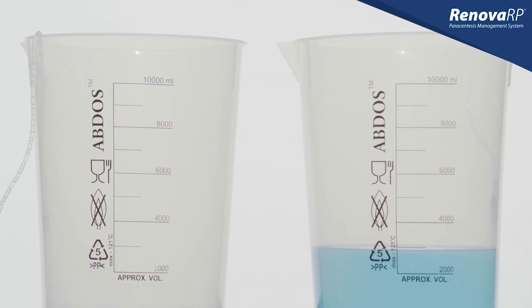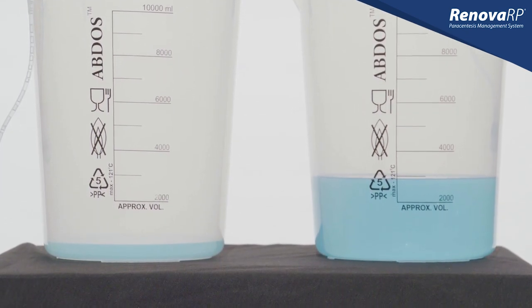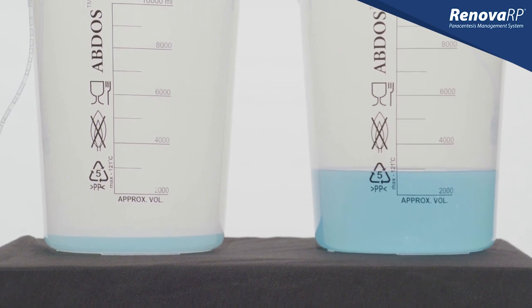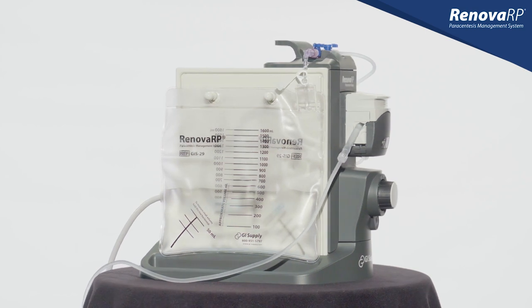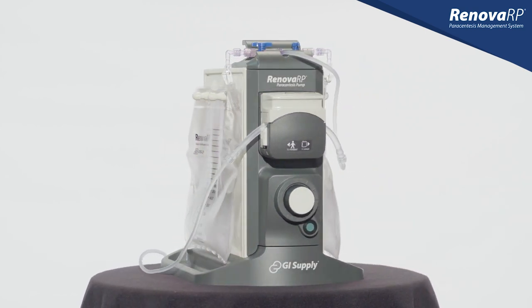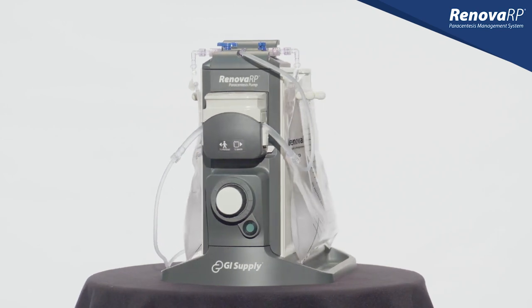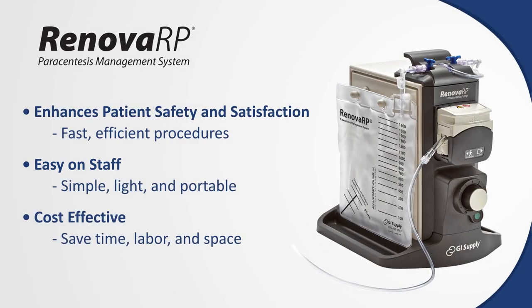The Renova drainage bags have a larger capacity than traditional 1-liter vacuum bottles. Therefore, fewer are required to complete a standard procedure. GI Supply's alternative to evacuated bottles is simple, portable, and offers fast, efficient procedures to enhance patient and staff satisfaction. Upgrade your paracentesis experience today with Renova RP.